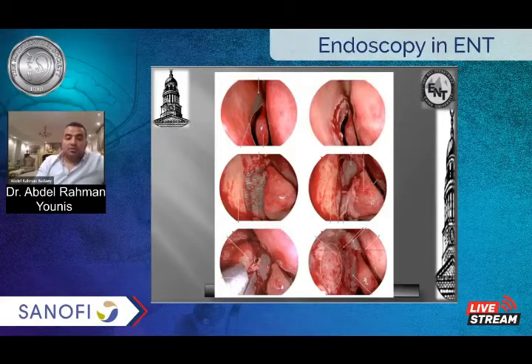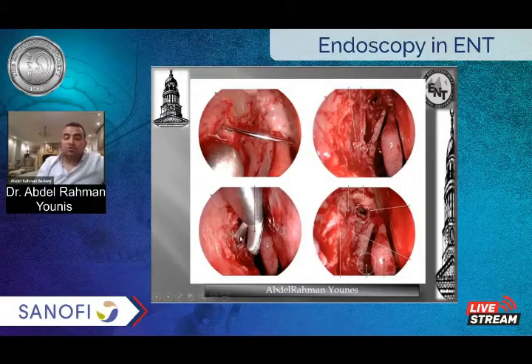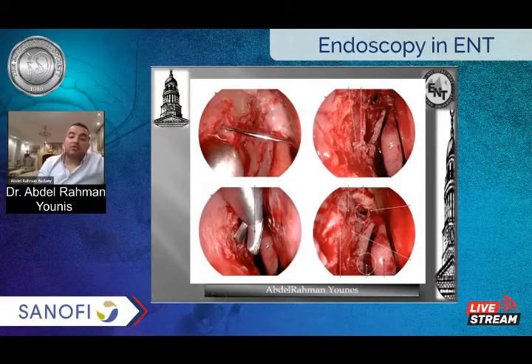Then we insert our bougie through the lacrimal punctum, through the common canaliculus in the upper part. We use a sickle knife to make a vertical cut in the nasolacrimal sac. We use a downward cutting maxillary forceps to enlarge it caudally. Then we insert our flap back in its opening to prevent its reclosure, taking care to have an excellent view of the drainage of the frontal sinus, not to be closed by our flap. So briefly, this is the step-by-step technique of doing a DCR.